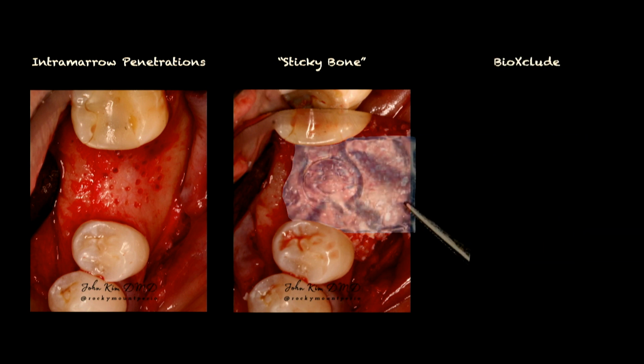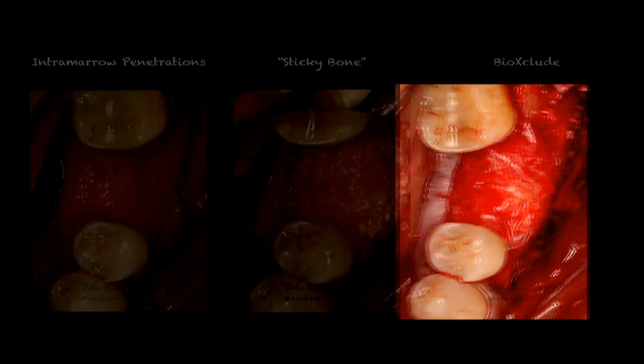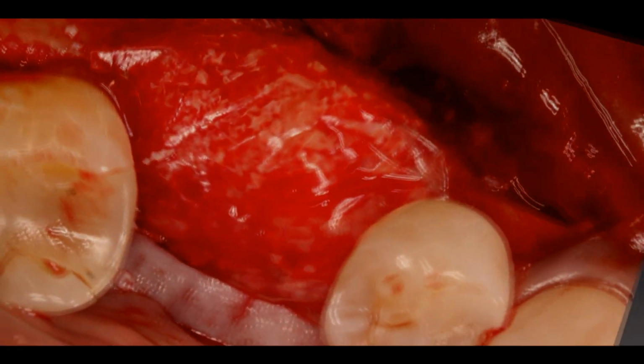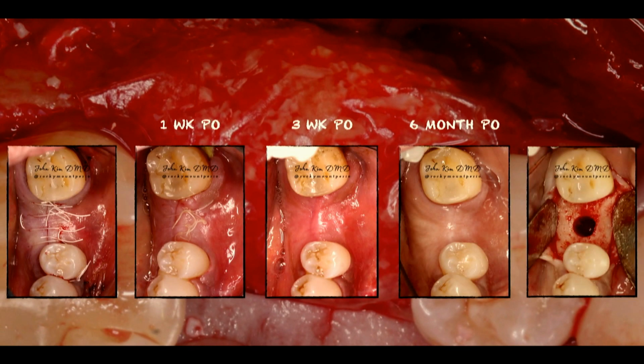So I got my BioXclude after the sticky bone is in place, and it drapes very easily. And you want to make sure you get a large enough membrane so that it extends onto the native bone, and it drapes, again, very well. I don't know if I have enough time to go through this whole summary here, as I want to show the outcome of this. But you can see good healing, 6 months out.